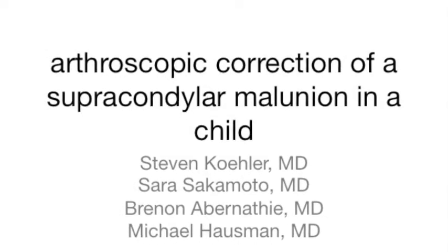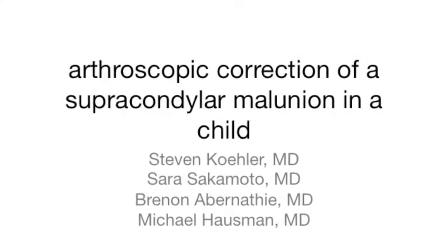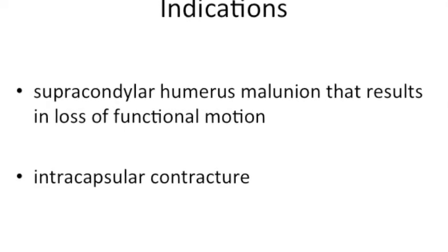This video presents the technique for an arthroscopic correction of a supracondylar humerus malunion in a child. We have no disclosures to make. The principal surgical indication for this technique is a supracondylar humerus malunion that results in a loss of functional motion.